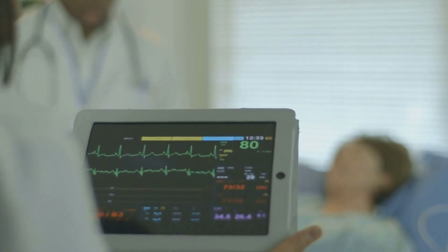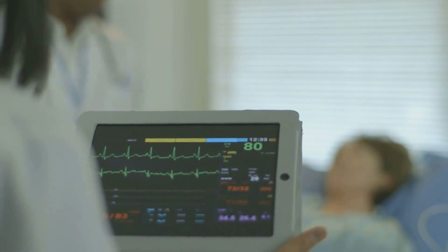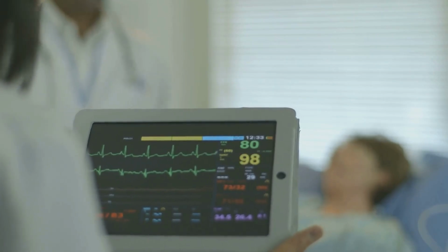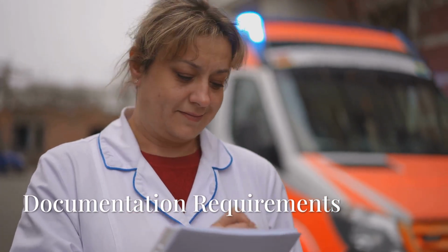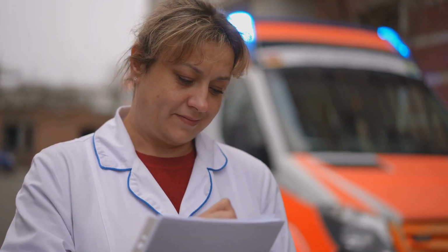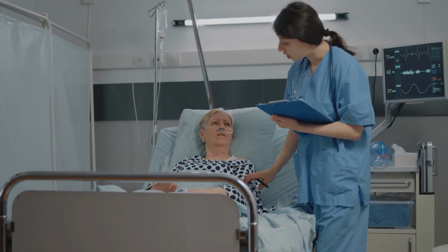After placing any airway adjunct, continuously monitor capnography. Reassess for proper placement. Watch for signs of deterioration, dislodgement, or obstruction. Your report should include indication for airway intervention, devices used, number of attempts, confirmation methods, patient response.